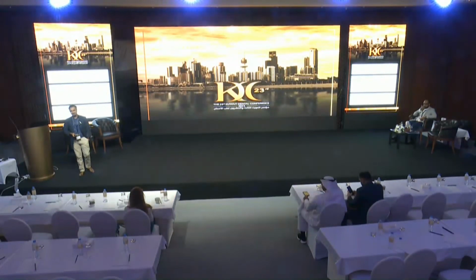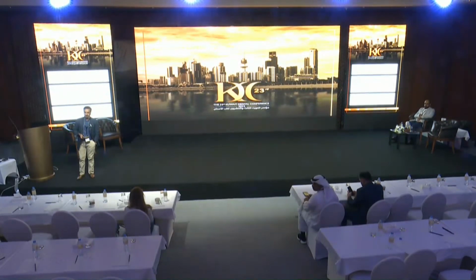Dr. Faisal, thank you. Quick question about the crown lengthening digital guide. Do you really incorporate a CBCT as well? Most of the cases, because when they send it to you without having a CBCT, it's just telling you like a soft tissue driven. And once you just use a soft tissue laser, you probably realize you're really in the risk zone.